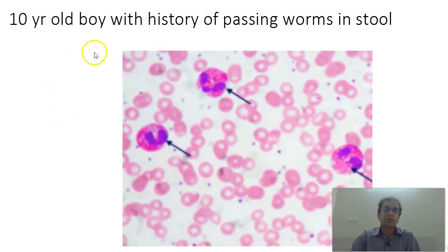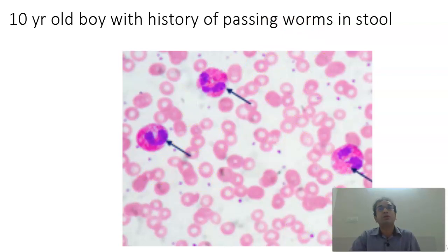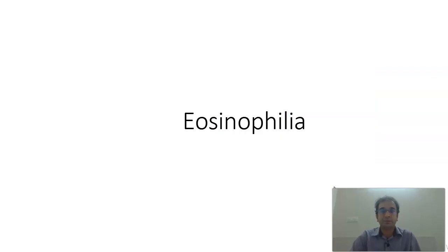Next history is that of a 10-year-old boy with history of passing worms in stools. You find a lot of eosinophils here in this field — it's eosinophilia. Causes of eosinophilia can be parasitic infestation, Loffler syndrome, Hodgkin's lymphoma, hay fever, and asthma.